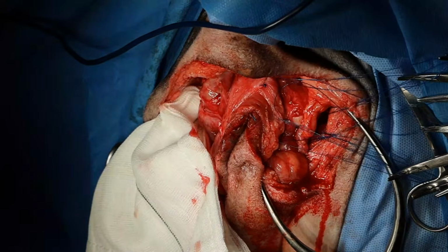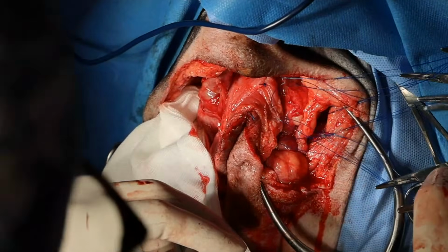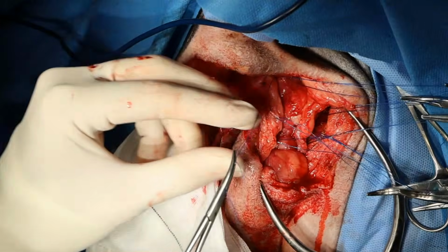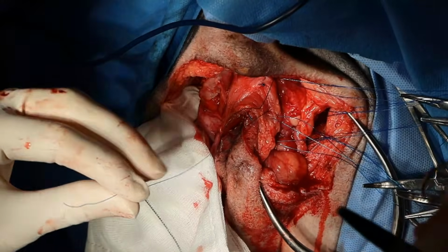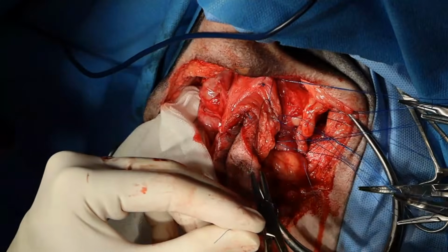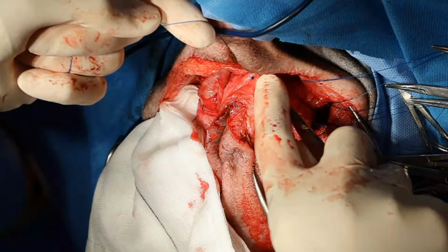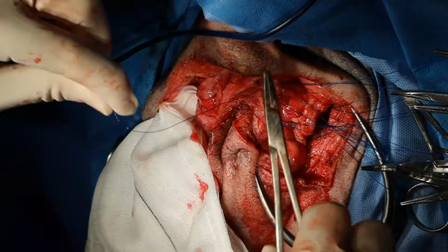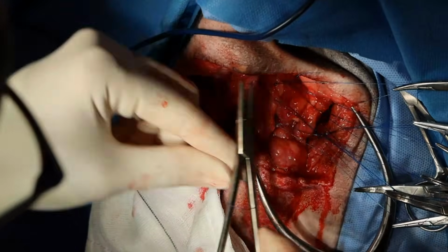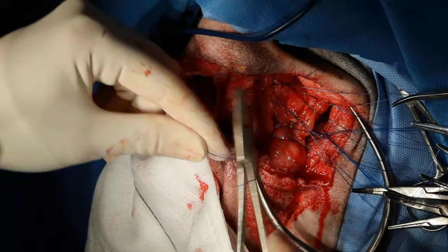So there's a question, is it a good idea to do a colopexy at the same time? Only if you need to. So in most cases you should not need to do that. Usually a muscle flap. Normally a good internal obturator flap is going to be more than enough to fix the problem. You can see that it's just really tucking that anus right up underneath the tail.